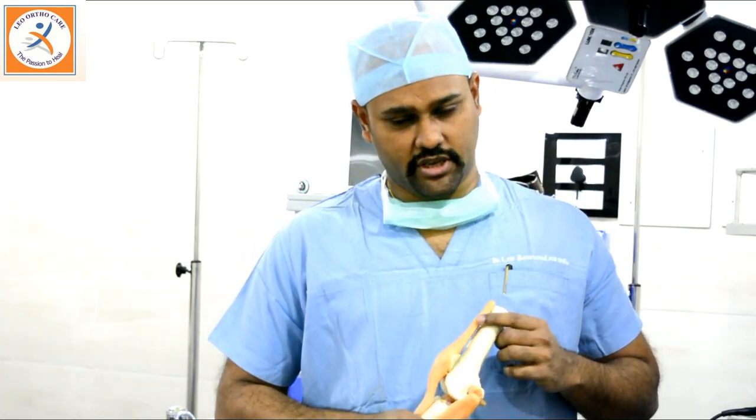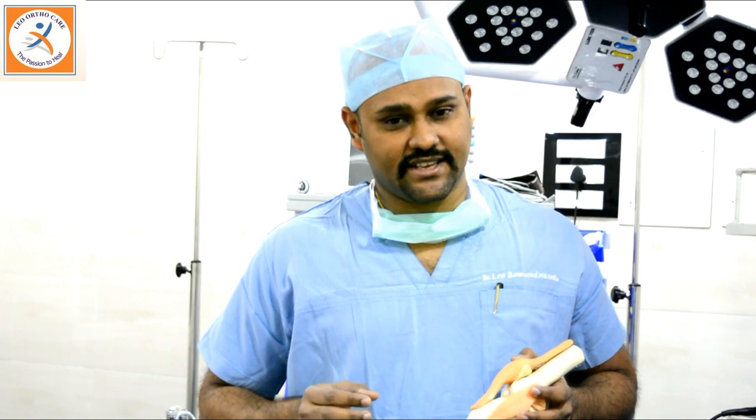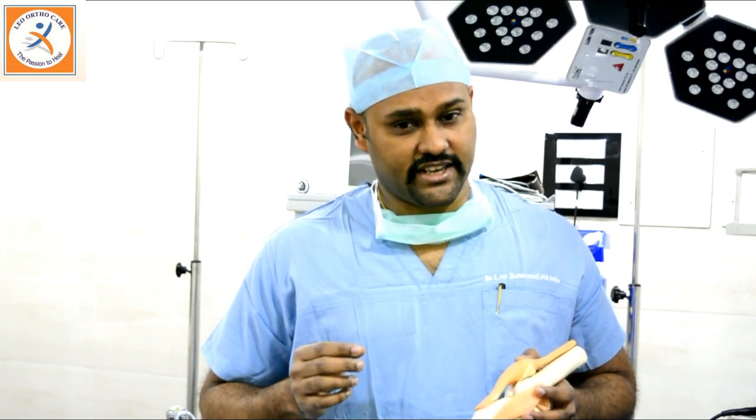What is the advantage of arthroscopy? Arthroscopy offers a pain-free modality compared to open surgeries which were performed in the previous era. Arthroscopy is done through two small incisions of about three to four millimeters. Patients are pain-free because of the small incision — we don't open up the joint. The blood loss is less, the scar is less, the operating time is less, and the cost is also less.